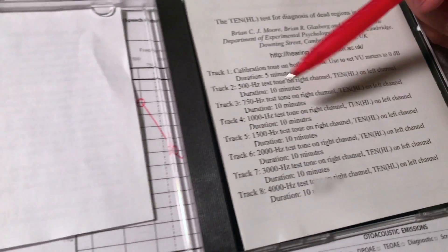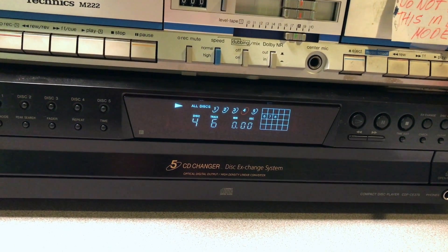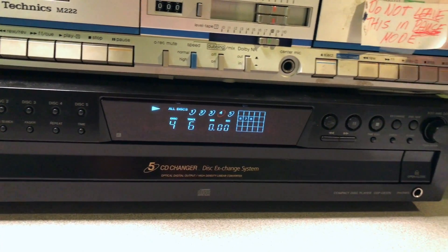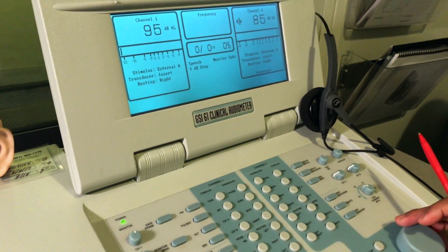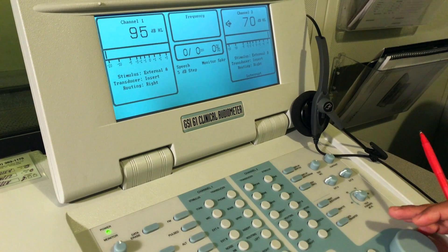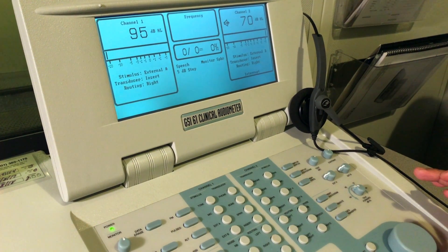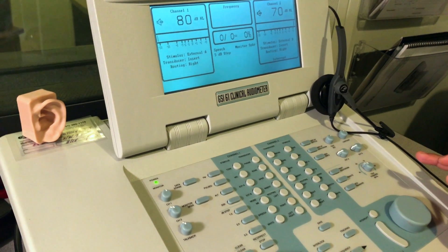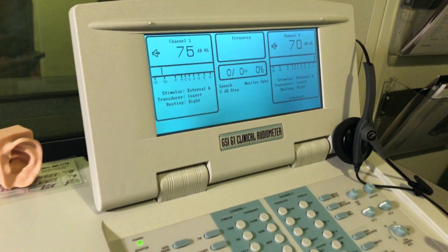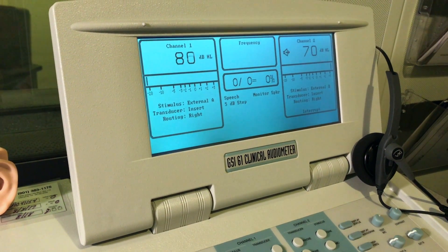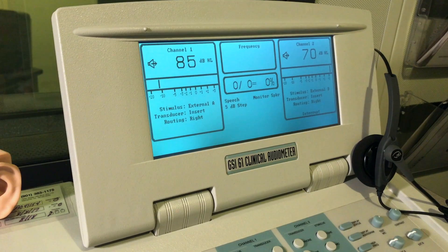You do the same, but what you need to do is just change the track to track 4. We were at track 6, go back to track 4, which is for 1000 Hertz, and set the noise level here on channel 2 to 70 dB. Make sure it's playing continuously and use external A to measure the person's threshold again.